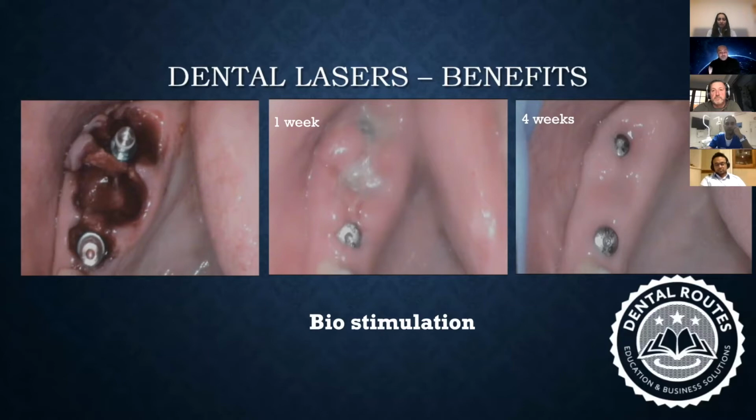And mind you, even when I do an osteotomy in a traditional delayed implant placement, with my traditional drill to make sure the measurement is right, to make sure the whole width is right and everything else, I dip my laser into that socket, leave it for a few seconds just for the energy to soak in, and then place my implant.